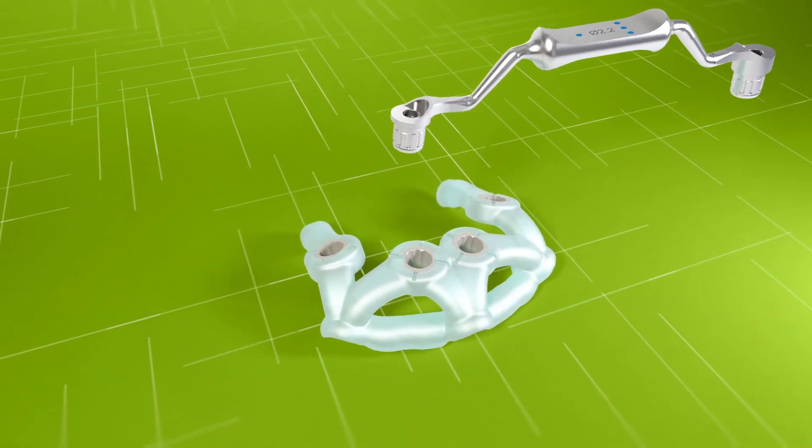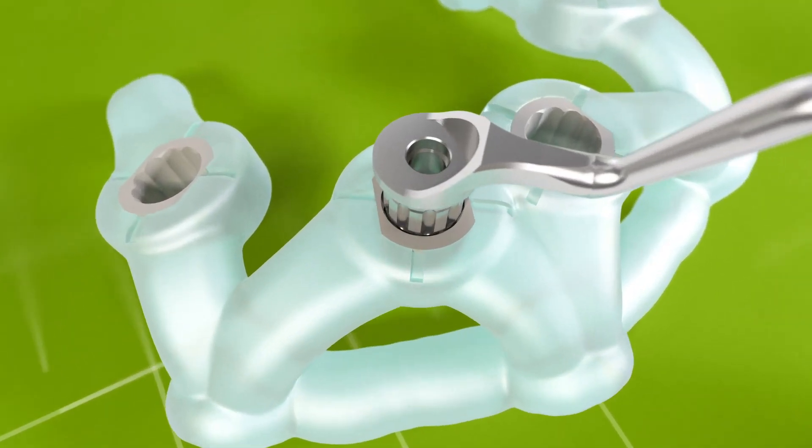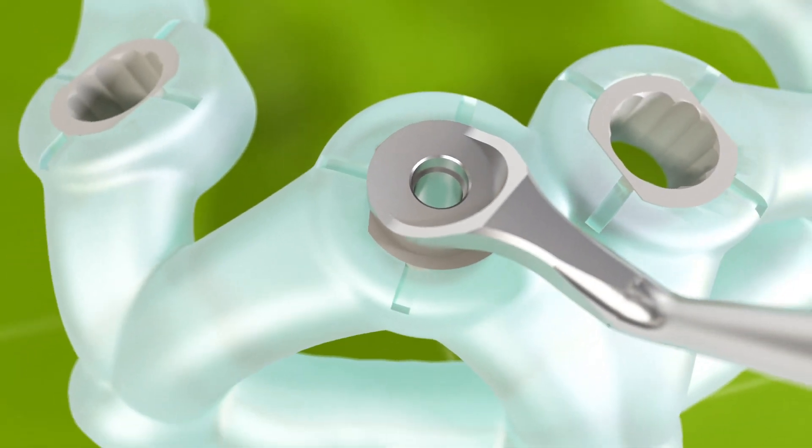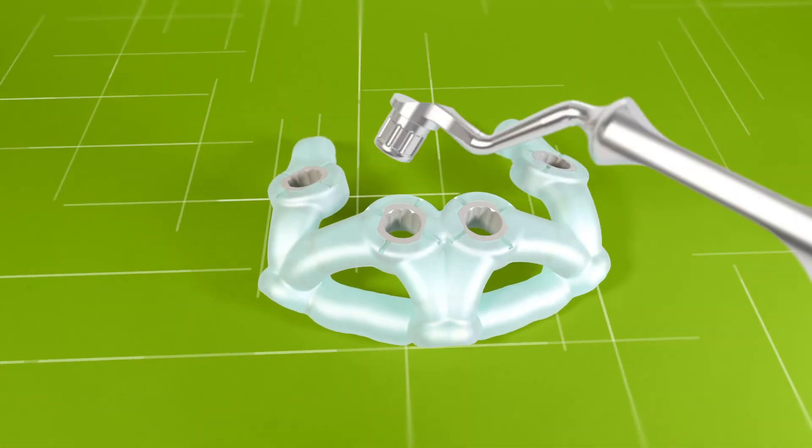The drill handles are locked into the T-sleeve by pushing vertically until a click is heard. Gently pull out vertically to remove the handle.